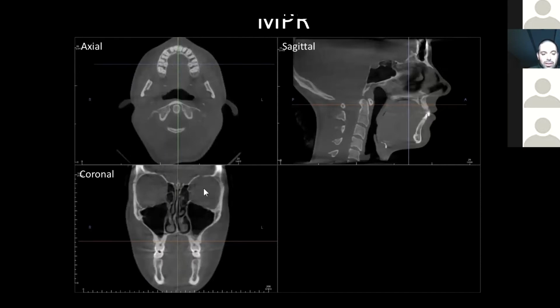And if I want to know, cut right through the teeth, I pick this line up and drop it here and look up in this view and know that I'm going to be cutting down the axes of these teeth. They all cross-reference each other, in other words. And that's what I mean by when lost, use your crosshairs. You can keep yourself from getting totally lost in the anatomy. Another thing too is any reasonable cone beam software, regardless of brand, will give you little clues. R and L for right and left, P and A for anterior and posterior, of course. Use those to your advantage.